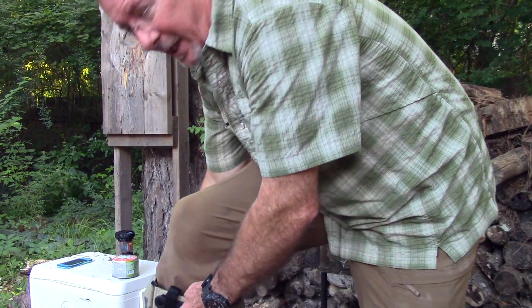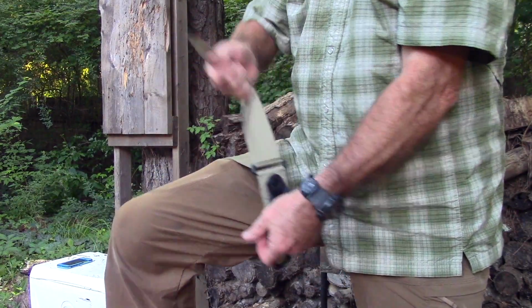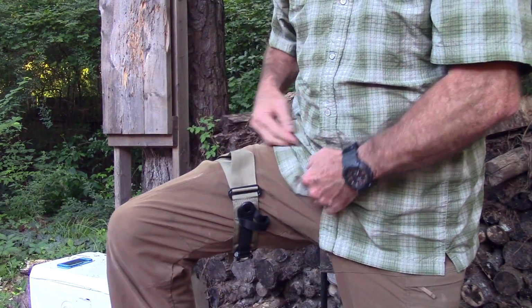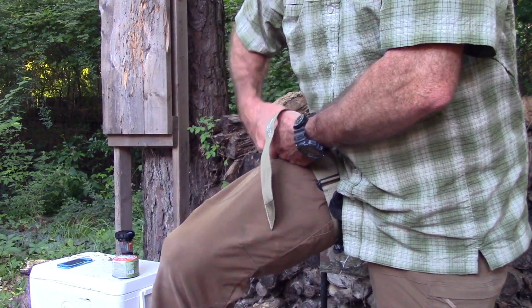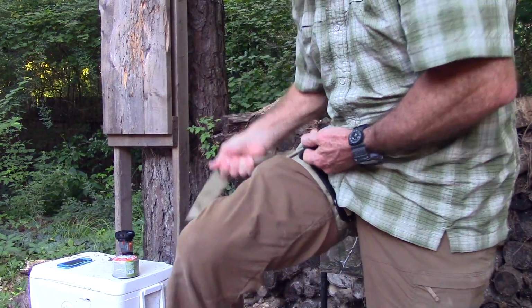So on your leg, it's pretty easy. You can put it up here on your leg like this. You hold this loop here and pull it as tight as you can get it first by hand. And by the way, you want to put a tourniquet as high, as close to the joint as you can. So you want to go way up high with it, just to have the most opportunity. This is a 2-inch wide band, so it's good. You pull it as tight as you can get it.